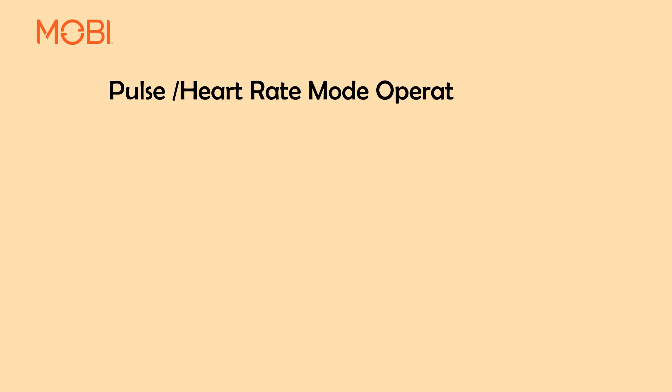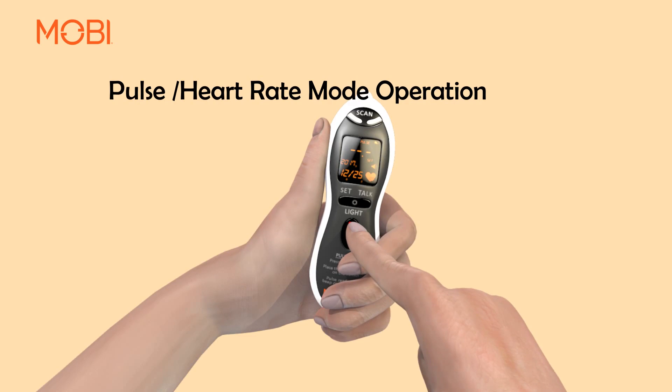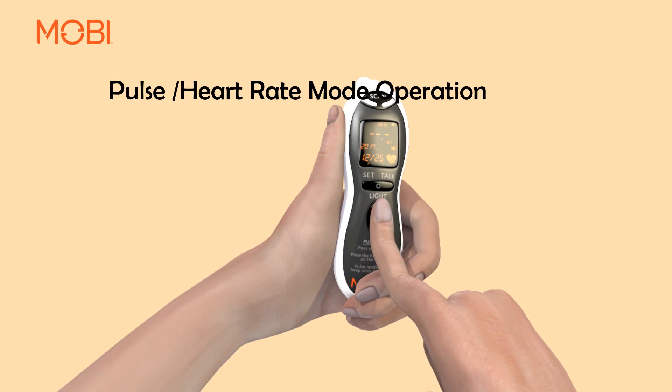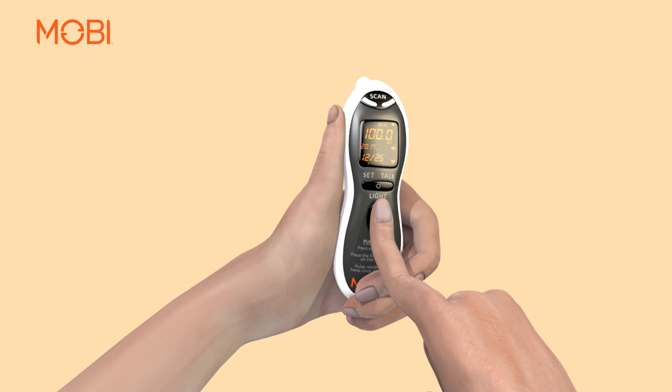Pulse Heart Rate Mode Operation: To measure your pulse rate, with your index finger centered on the sensor, press and release the heart rate button once to activate the feature. Rest your finger lightly on the sensor until the unit beeps and the pulse count appears on the display. As you let your finger rest gently for 5 to 10 seconds, avoid any movement or talking for better accuracy. The larger heart symbol on the display will begin to flash in sync with your heartbeats.